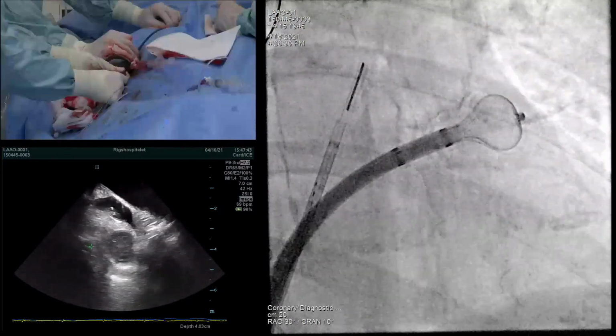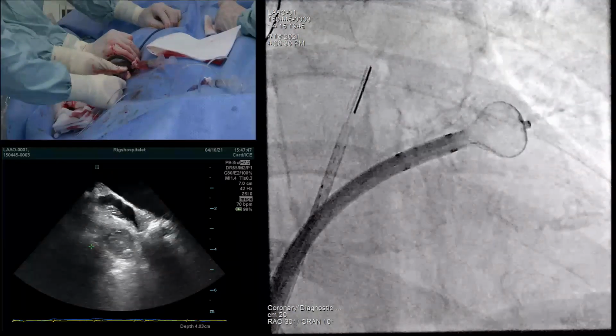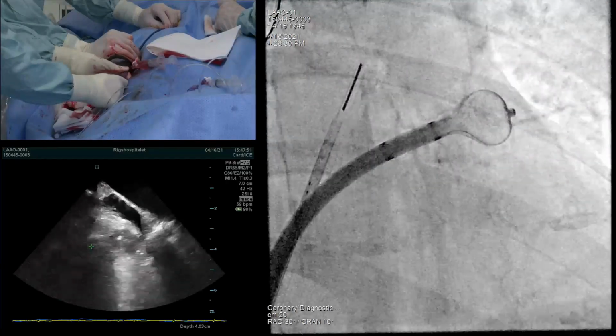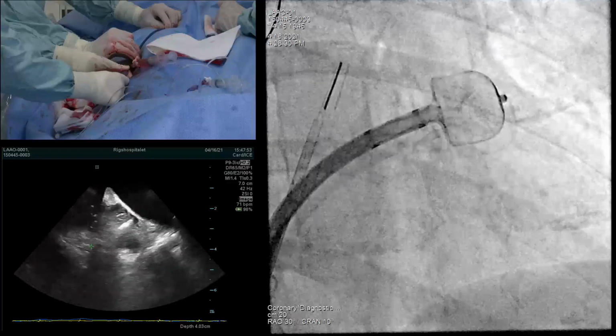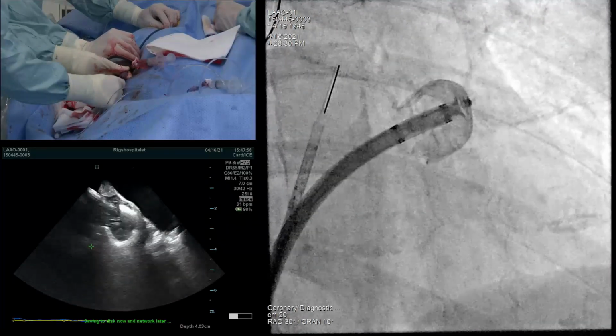It's a very atraumatic device, so you can push the device forward. And then we do a combination of pushing out the device and pushing also forward the delivery sheath, actually. And that's something else than you do. You see, that's the maneuver we like to see.